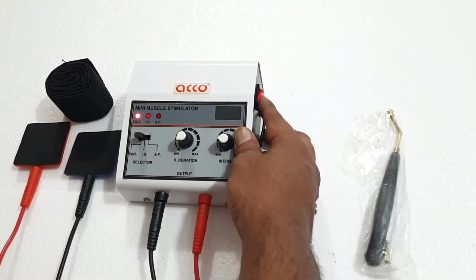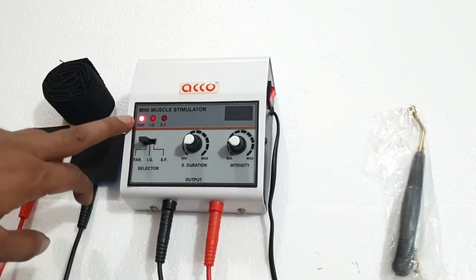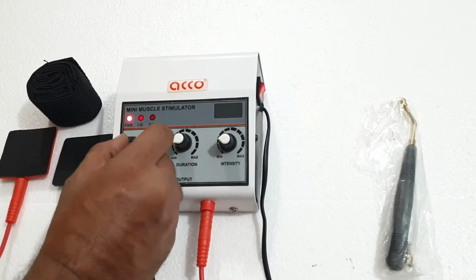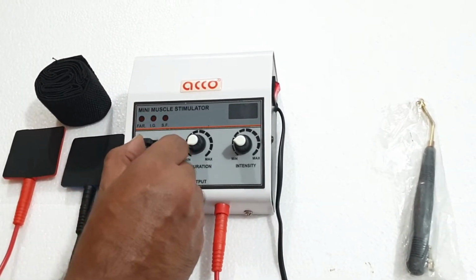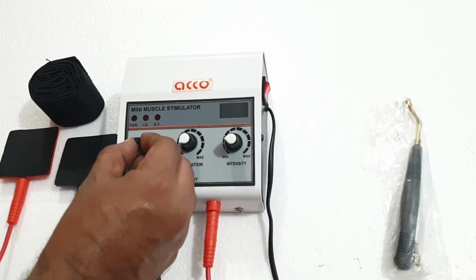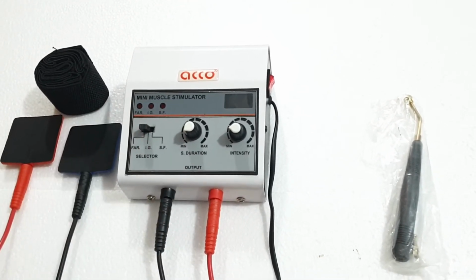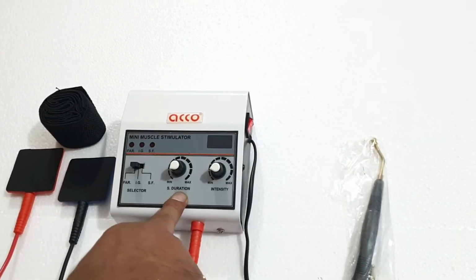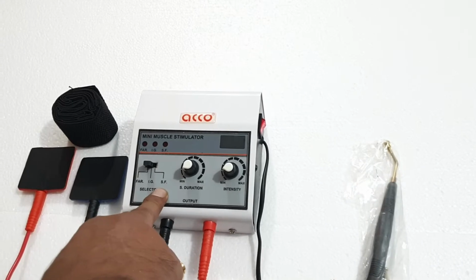Switch on the machine. These are the three currents: Faradic, interrupted galvanic and surge Faradic. You can select the current as per your requirement. This is surge Faradic, interrupted galvanic. Surge duration is used in surge Faradic current.